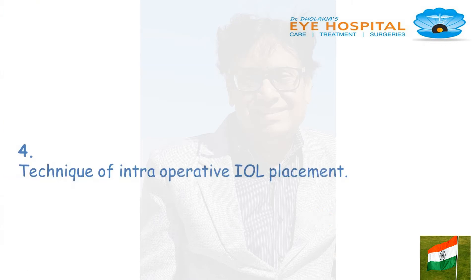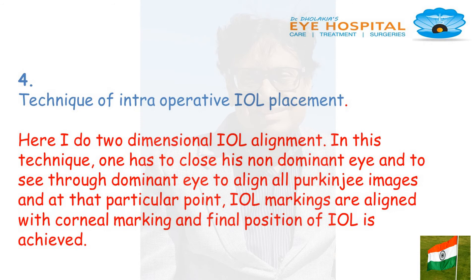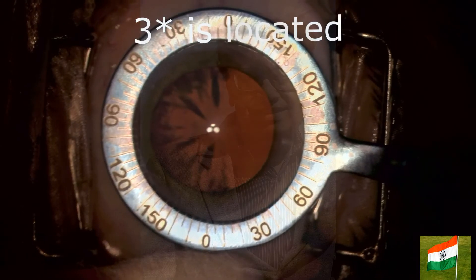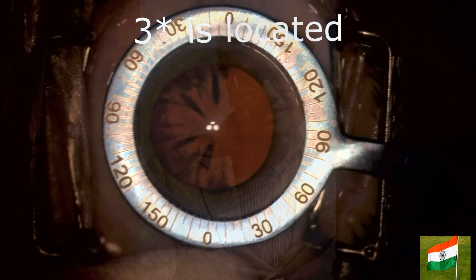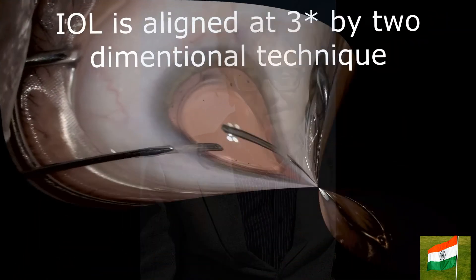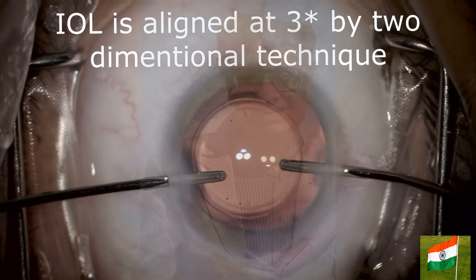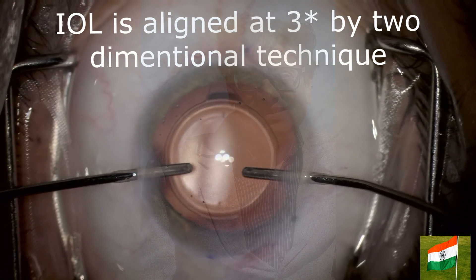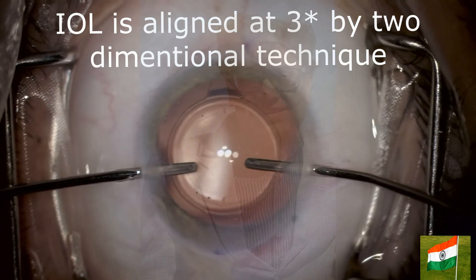Topic 4: Technique of intraoperative IOL placement. Here I do two-dimensional IOL alignment. In this technique, one has to close the non-dominant eye and see through the dominant eye to align all Purkinje images. At that particular point, IOL markings are aligned with the corneal markings and the final position of IOL is achieved. Here, 3 degrees is the target — the IOL is aligned at 3 degrees by the two-dimensional technique. My left eye is closed and my right eye is open.